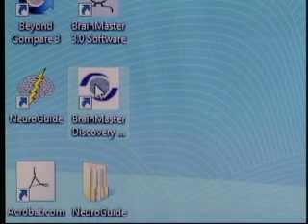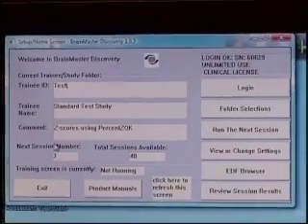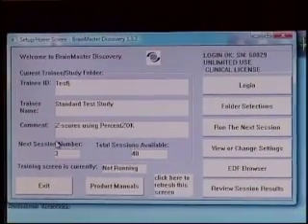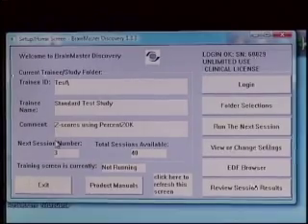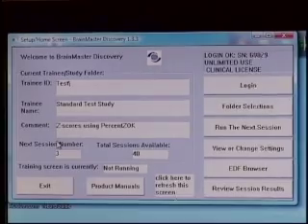The software's been installed, so you'll see on your desktop a BrainMaster Discovery icon right here. This is the entry point to the software that we will be using to record, monitor the EEGs and to store them. So I simply double click on that icon, and now we're looking at the welcome screen, which we also call the setup control home screen for the BrainMaster Discovery software. This is very similar to the Atlantis software, but it has some more features.